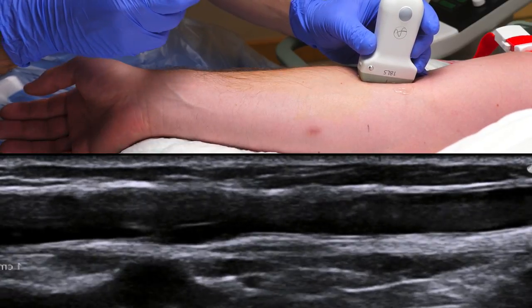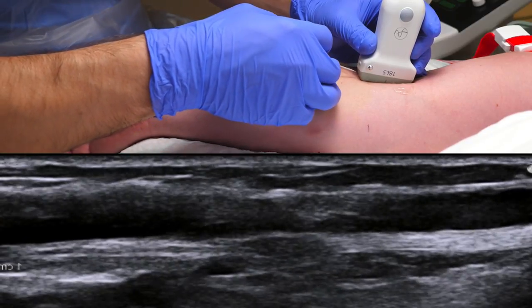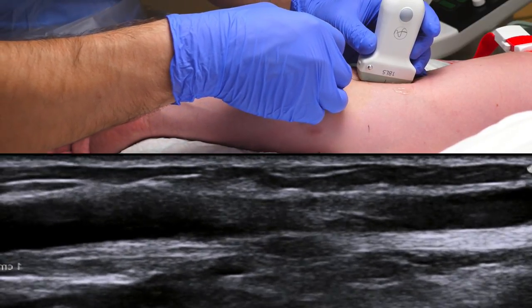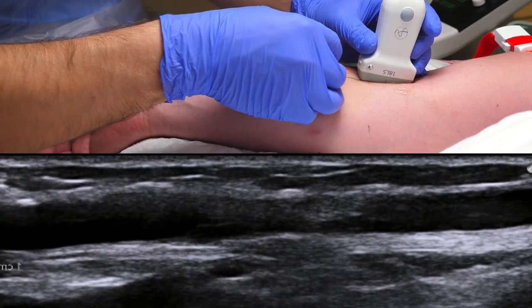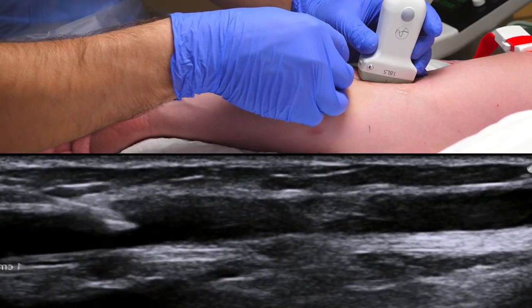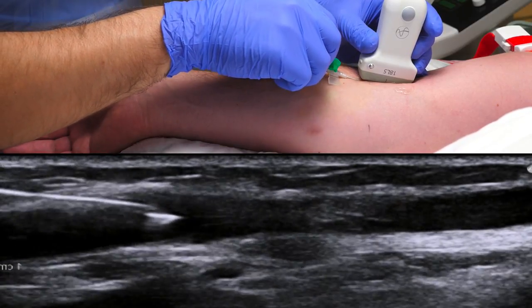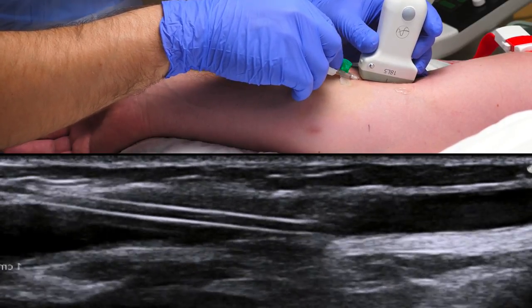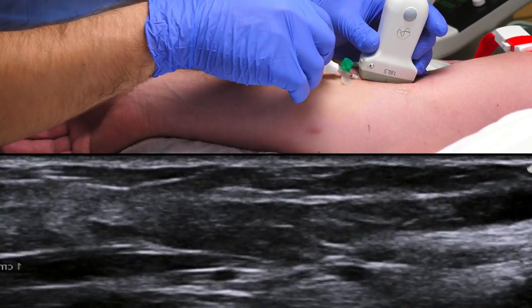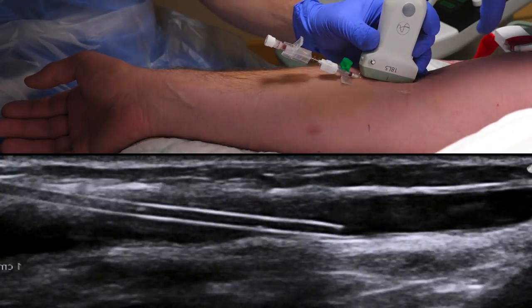While being very careful not to lose our orientation of the vein, we puncture the skin in the midline of the probe and insert the catheter along its long axis. We can see the catheter come into view in the ultrasound picture, and there we puncture the vein, which is also when we get the backflash. Advance the catheter and retract the stylet. Note how this view allows us to assess how much of the catheter is actually in the vein, as this correlates to how easily it will dislodge.